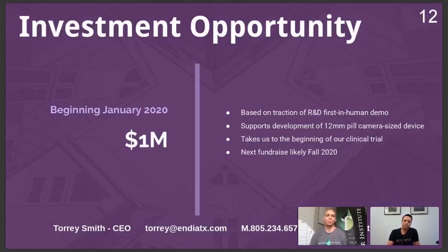Christian asked, how much mobility do you feel that your device can accomplish? That is such a good question. I mean, this thing is a swimmer, right? So it's really good at swimming through clear liquid, which means that our patients would have to fast for 24 hours. They have to drink about 2 liters or more of this horrible clear liquid. It's actually pretty uncomfortable. But in that very artificial condition, suddenly we have this amazing ability to move around in 6 degrees of freedom. And so we have to prep our patients, but once we do, we see some incredible opportunities to move around and get deep into the body where you just can't reach effectively or safely with scopes.